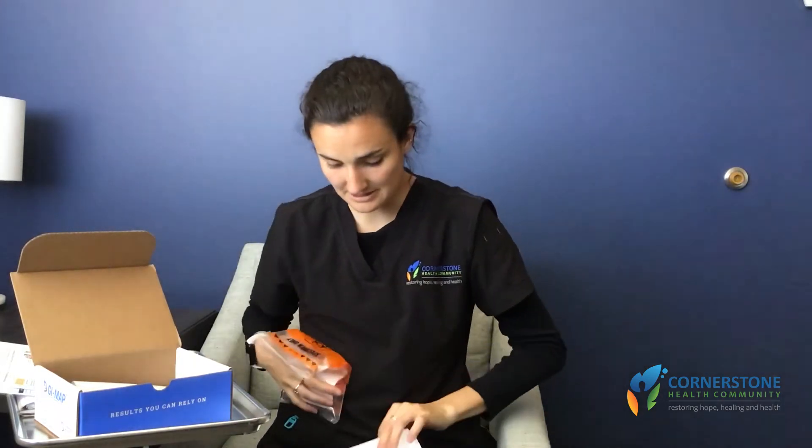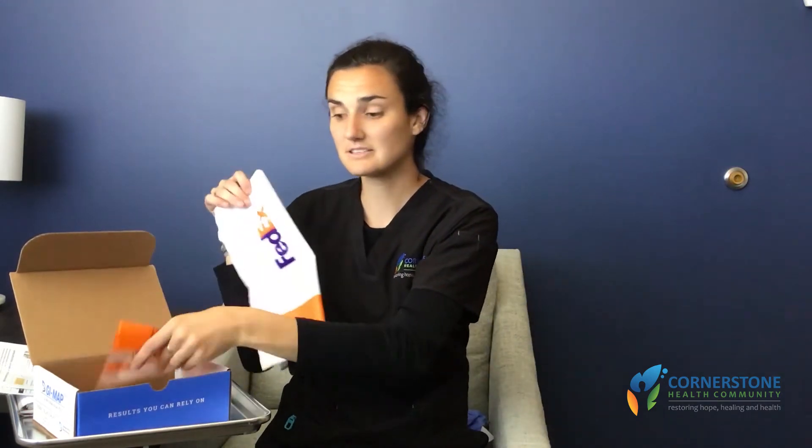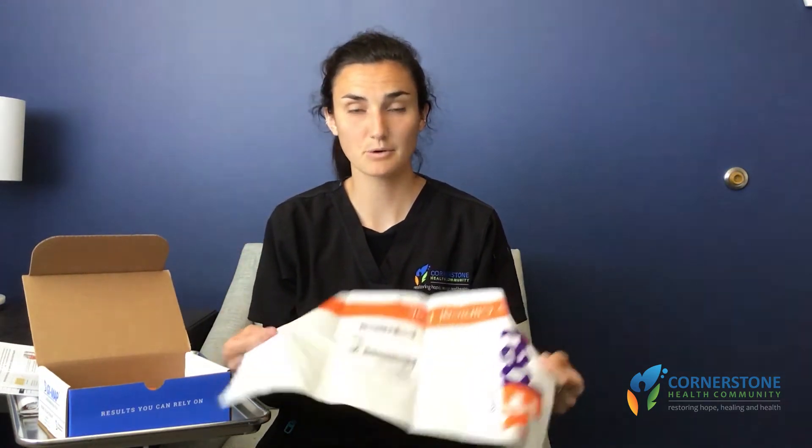After that, please put it into the biohazard baggie and shut that tight. You can then discard your gloves and the french fry carton. Then place the vial inside the box, and the entire box along with the requisition form will go inside your prepaid and pre-labeled FedEx sleeve.